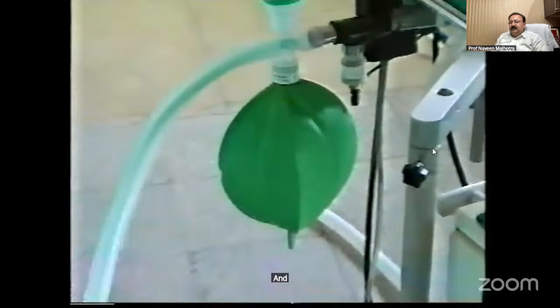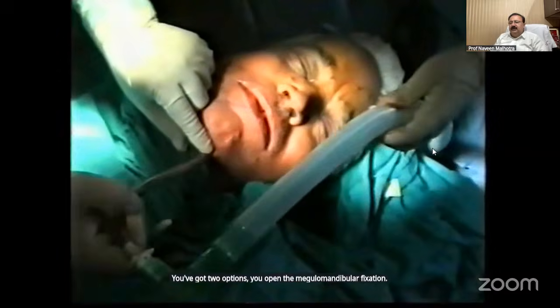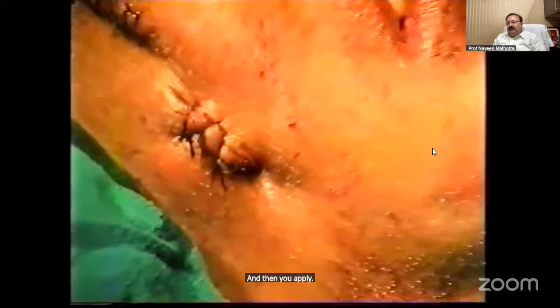And at the end, again, you've got two options. You open the maxillomandibular fixation, do a thorough suctioning, and you can take out the tube through the submental tunnel, or you can convert it to the oral route and then extubate. And then you apply interrupted sutures with 1-0 or 2-0 silk.